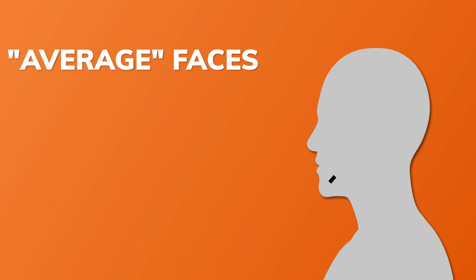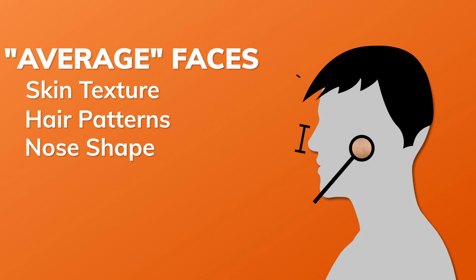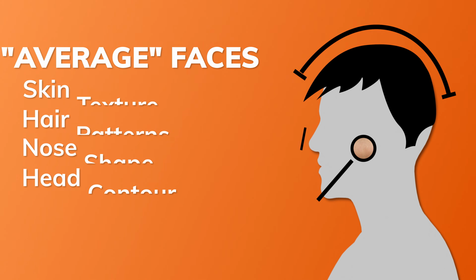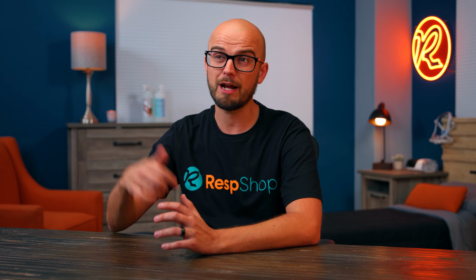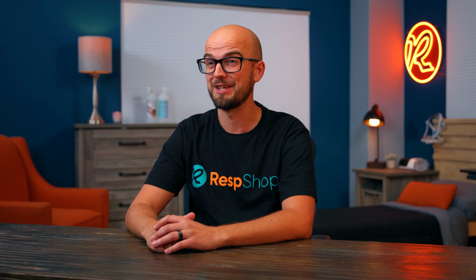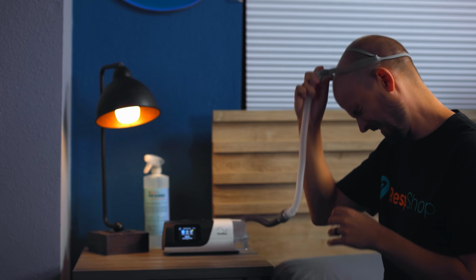Now, most CPAP masks are modeled on what you'd call average faces: average skin texture, average hair patterns, average nose shapes, average head contours. So in CPAP world, which is a crazy world, a non-standard face can be anything from ones with facial hair, long thick hair, curly hair, and even no hair. Or it can include less usual facial features like an aquiline or Roman nose shape, or softer, more squishable noses. They sound fun.